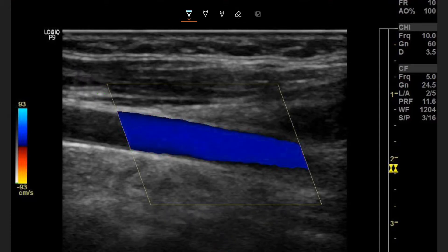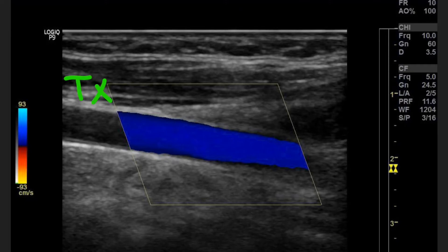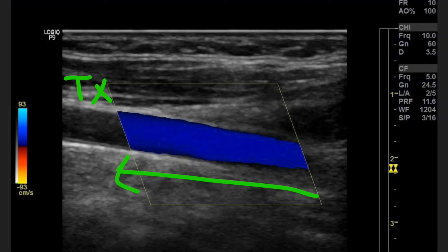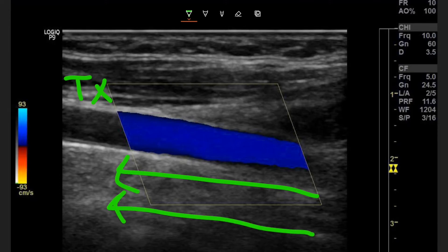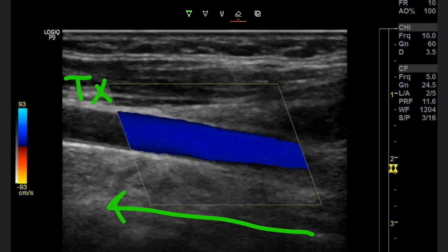Now the color in our vessel is blue, and we know that blue is what's coming towards the transducer. We still have our transducer location over here on the left, so we're going from right to left because we're coming towards the transducer.